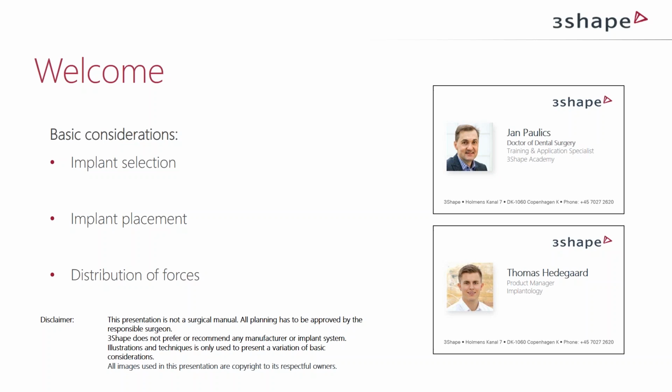Again, this is not a manual, and all planning that you are doing, either as a referral or as a laboratory or a colleague, you have to get approved by the actual surgeon doing the surgery. So the responsibility is always in the surgeon's hands. Also, some of the images that we are using today come from other places than 3Shape, so we have marked them with the respective brand where they come from. So welcome again to basic considerations.